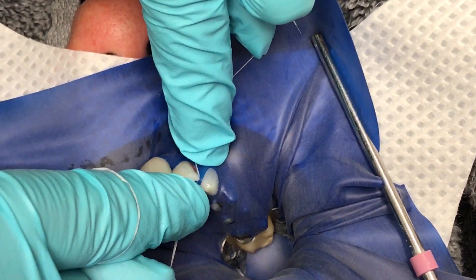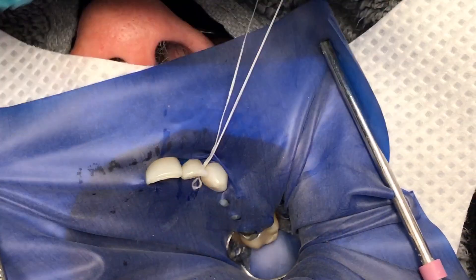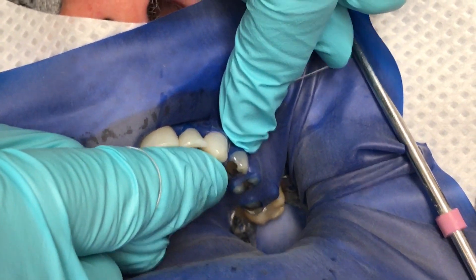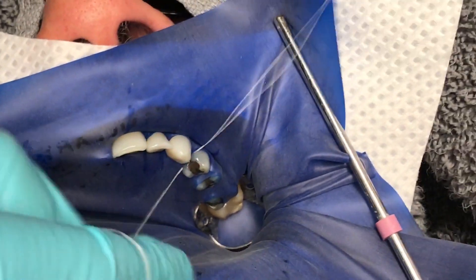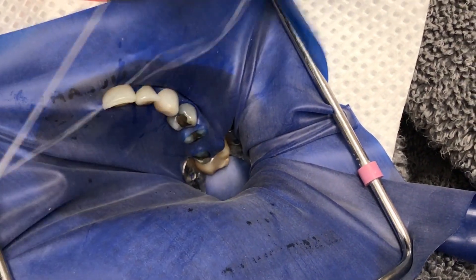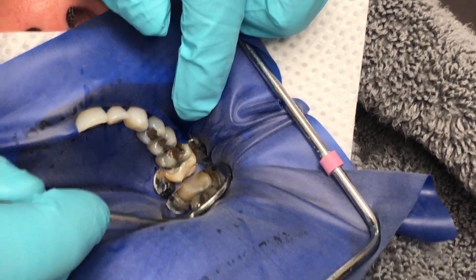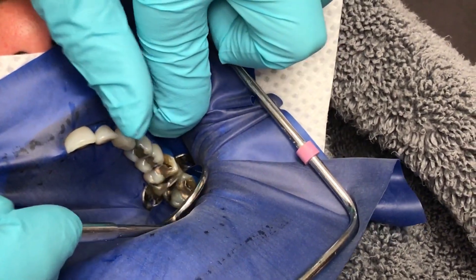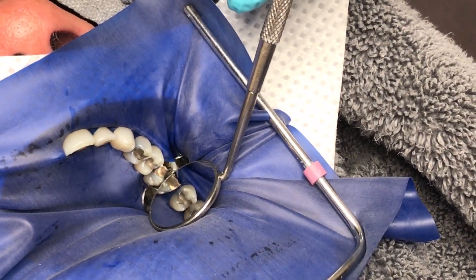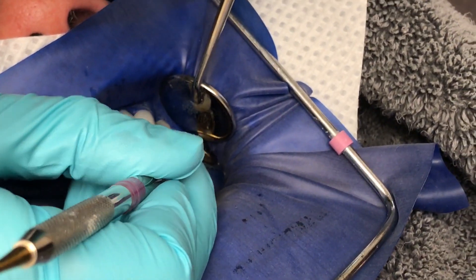Once I have flossed down once, I leave my floss in place and use the longer section of my floss to wrap and floss down again, then pull the floss out of the side. I then continue by working my way back towards the clamp, flossing each tooth as I go. Sometimes it is easiest to floss the distal of one tooth and then floss the mesial of the adjacent and pull the floss out of the side. Once I have flossed each tooth, I use a dental mirror to inspect that each segment of my dental dam has been flossed fully. If any spots still need more flossing, I floss that area again and then check with my mirror.